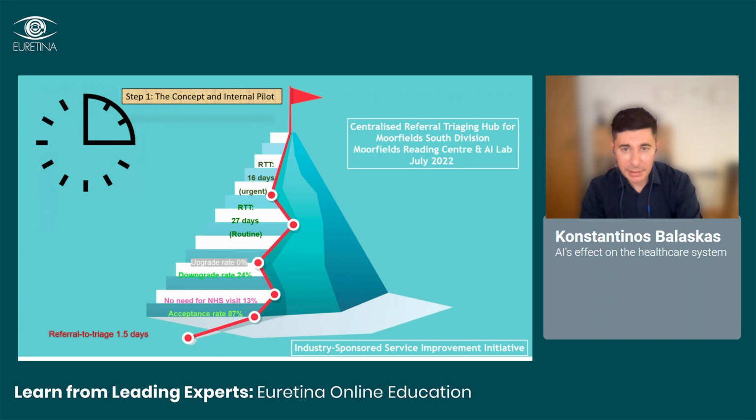the system and patients. In this pilot first implementation, we were able to reduce the number of unnecessary referrals that we were receiving from the community by 13%, and also to downgrade the level of urgency in 1/4 of cases. Where everything was referred as urgent, but not everything turned out to be urgent.